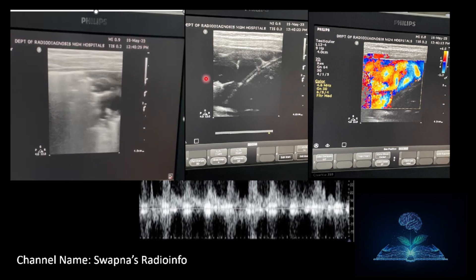This is a real-time grayscale ultrasound scan showing anechoic tubular cystic lesions with posterior acoustic enhancement. On color Doppler, it shows a vascular structure with turbulent flow manifesting as a mosaic flow pattern, and perivascular color flow artifacts were noted. This is the spectral Doppler.